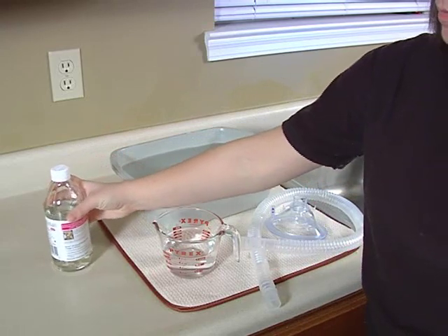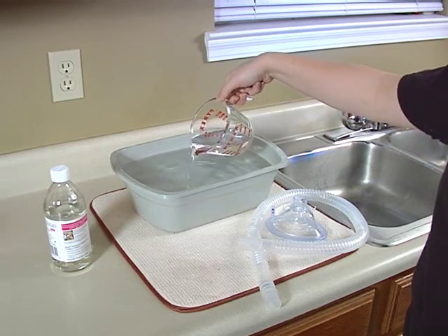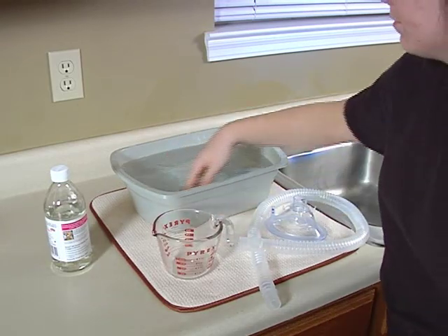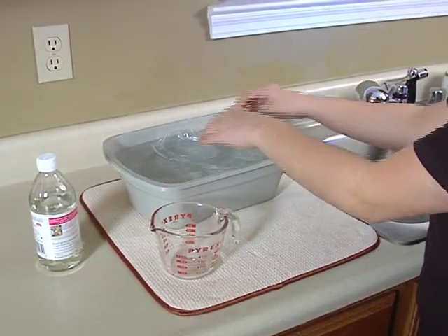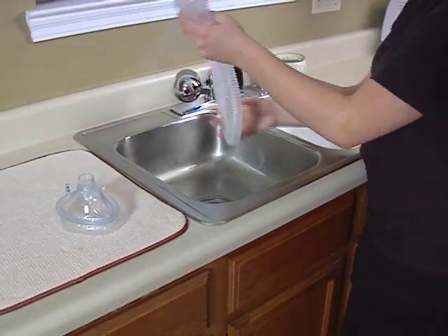Disinfect with a vinegar and water solution. Soak in a solution of one part white vinegar — five percent from the grocery store — to two parts water. For example, use one cup of vinegar to two cups of water. Make sure your equipment is completely covered. Soak for 30 minutes to two hours. Rinse with hot water. Place on a towel and let air dry overnight.